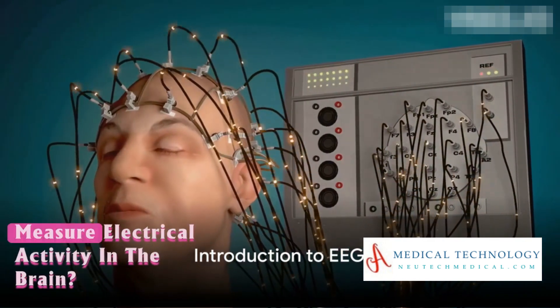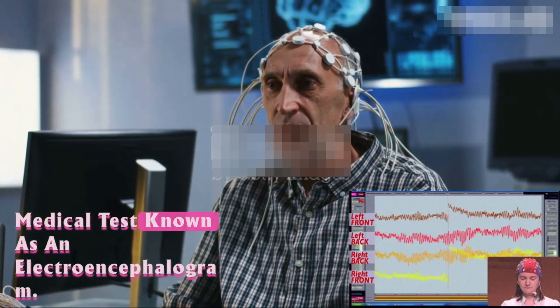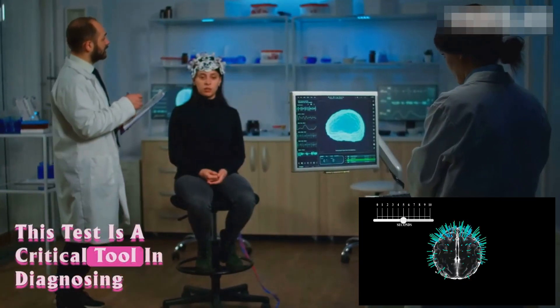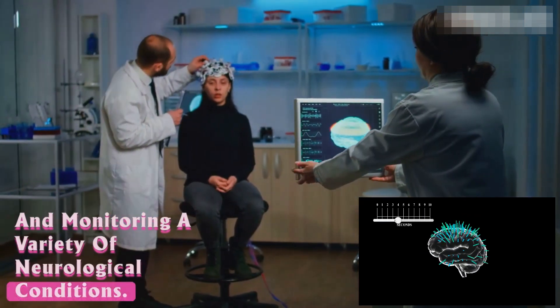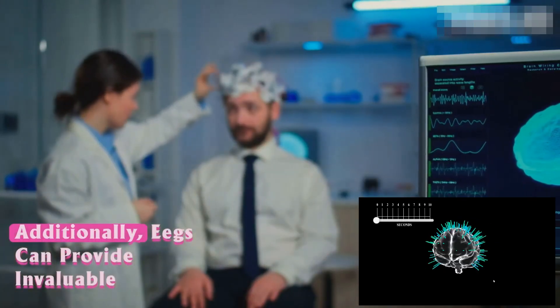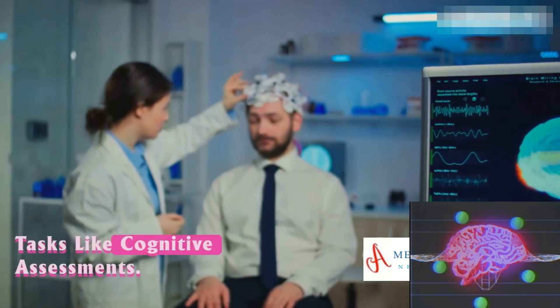Have you ever wondered how doctors measure electrical activity in the brain? It's a fascinating process involving a medical test known as an electroencephalogram, or EEG for short. This test is a critical tool in diagnosing and monitoring a variety of neurological conditions, including epilepsy, sleep disorders, and brain injuries. Additionally, EEGs can provide invaluable insights into brain function during tasks like cognitive assessments.